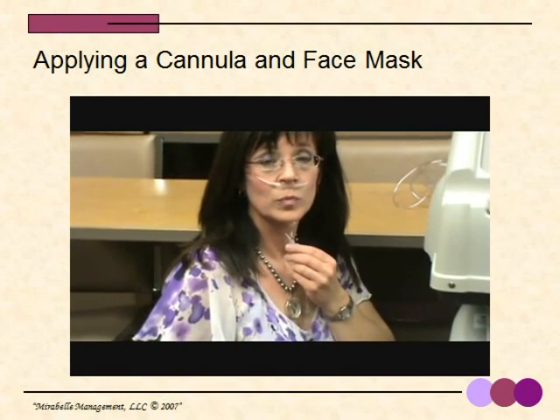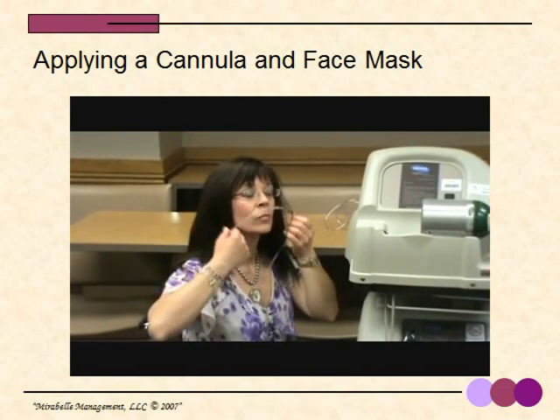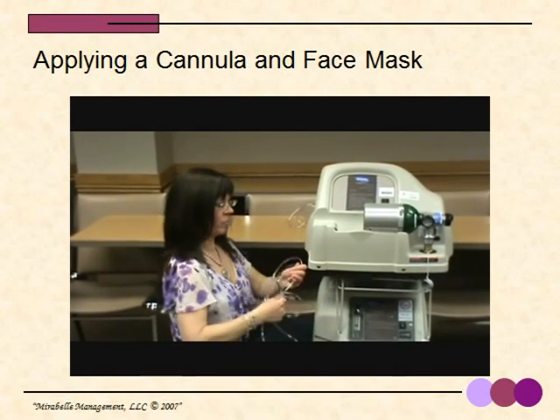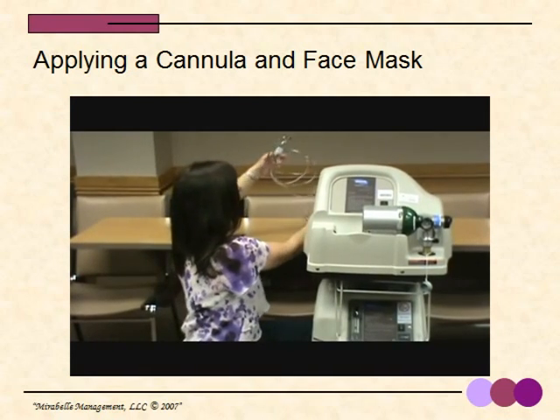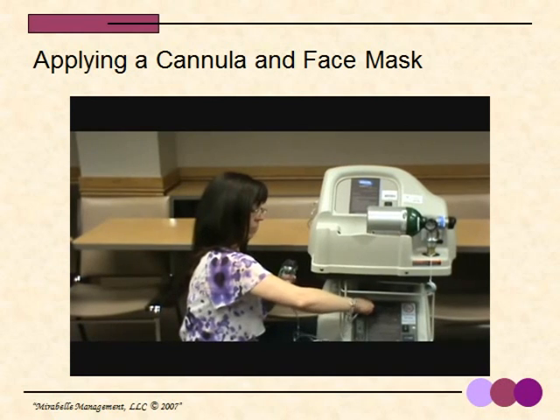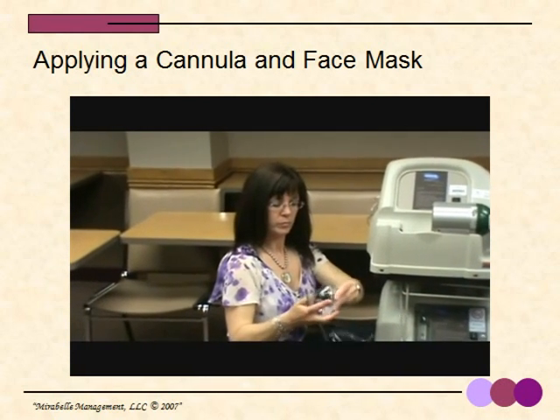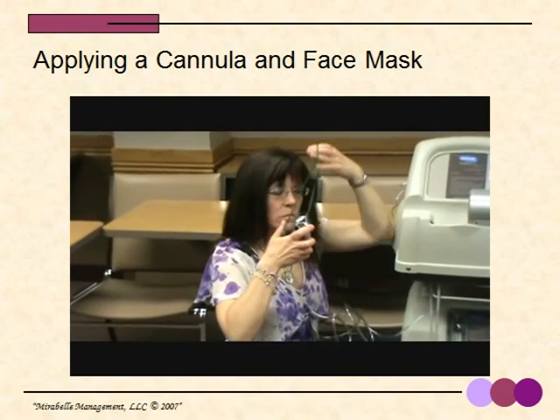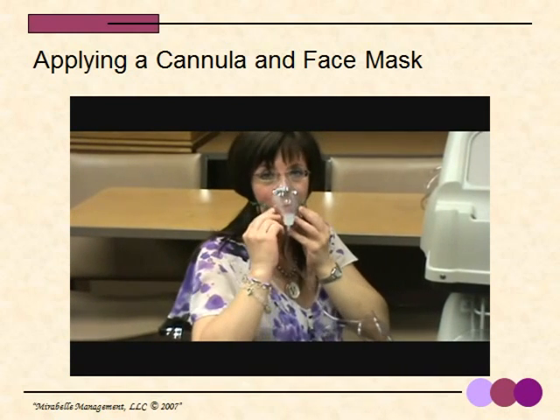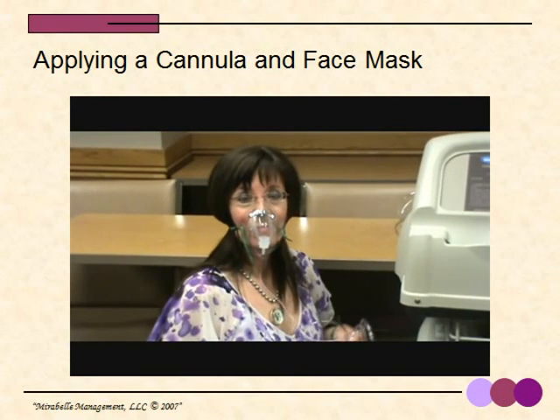Now, if we're going to switch from a cannula to a mask, we would take off the cannula, disconnect it from the concentrator, and attach the mask in the same way as we attach the cannula, and apply the mask. And again, we want it to be secure but comfortable. And that is how to use a concentrator.